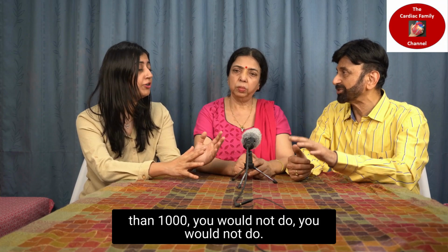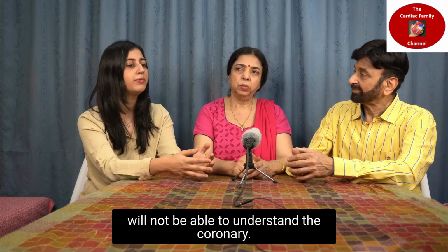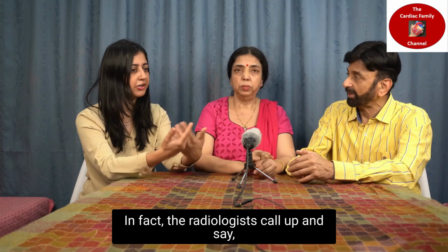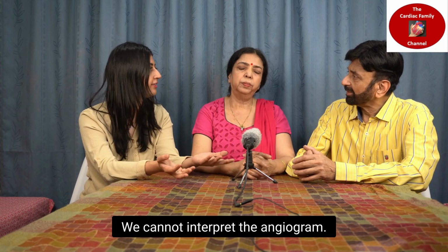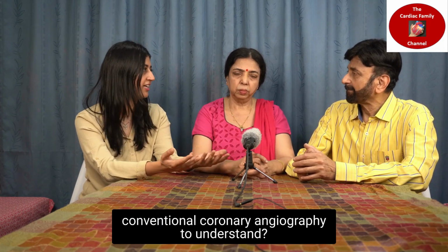You will not do it. Depends. If that calcium is very dense, you will not be able to understand the coronary anatomy. There will be so much opacification there, it's a waste of a test. In fact, the radiologists call up and say, no, the calcium score is too much, we can't do it. You cannot interpret the angiogram. So why don't you do a conventional coronary angiography to understand?